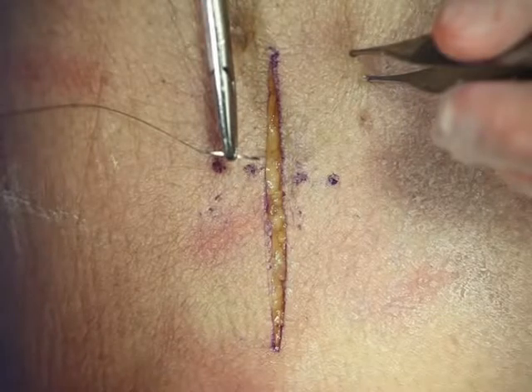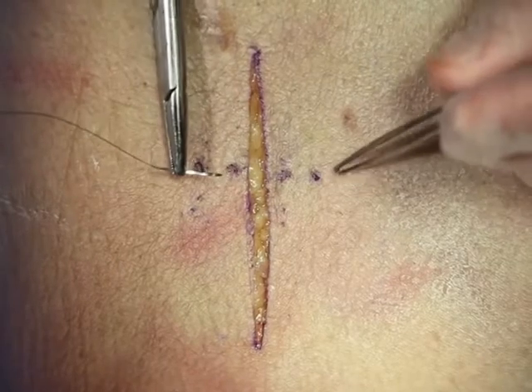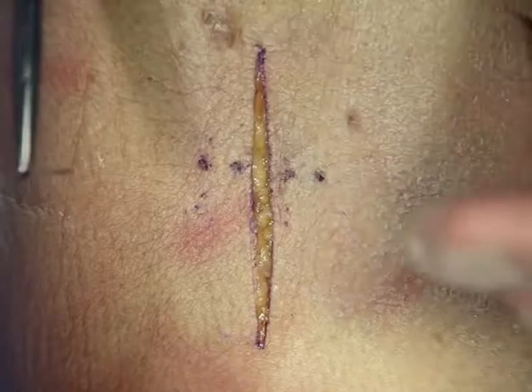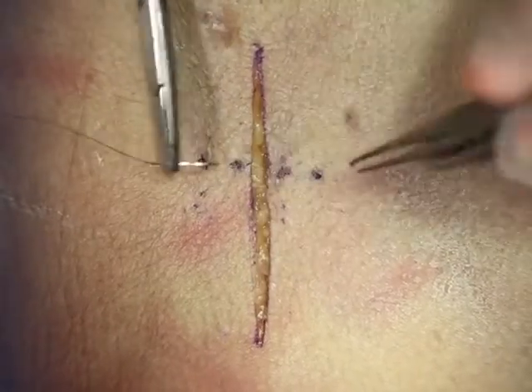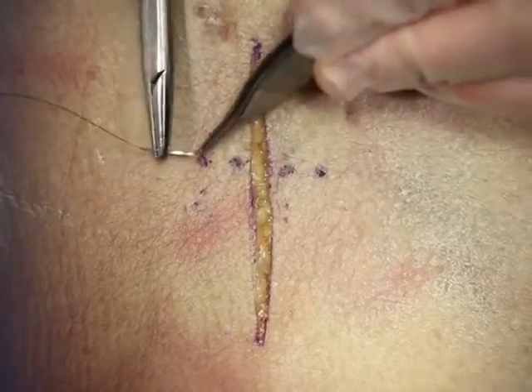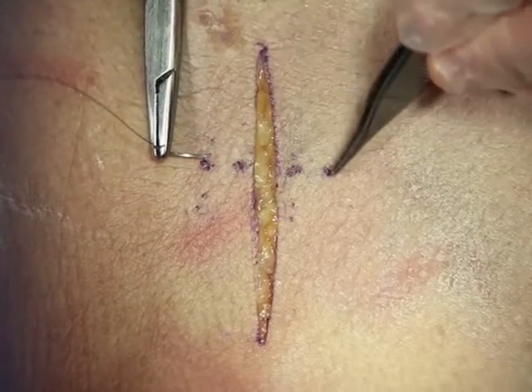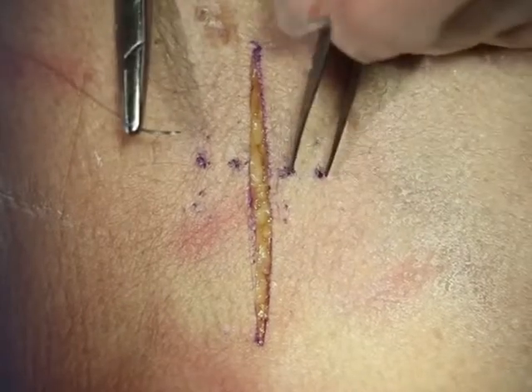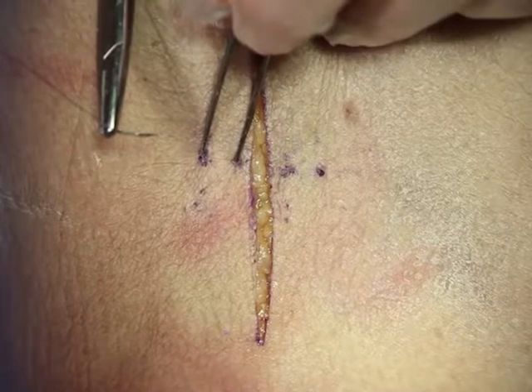Next is the vertical mattress suture. The vertical mattress suture is a very useful suture, especially when wounds are hard to close because they're under a lot of tension, or there's swelling, or you anticipate swelling. It's especially valuable when skin edges tend to roll in and you want to evert them. Some will call this the far-far, near-near stitch. We're going to enter far from the wound, travel under the skin, come out far, and then come back and go near-near. Essentially, you're taking this part of the skin and closing it to that part — that's the power of the suture, as opposed to a simple suture which relies on a much smaller area.